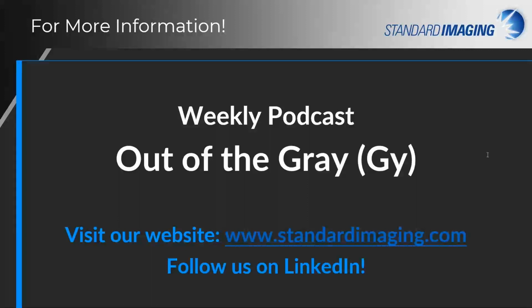So we work very closely with you. Like I said, our customer care team is there to help you get started, to make sure that your devices are configured correctly with all the data that they need to have in order to be used, for example, with the TG51 spreadsheets for ion chambers and electrometers.